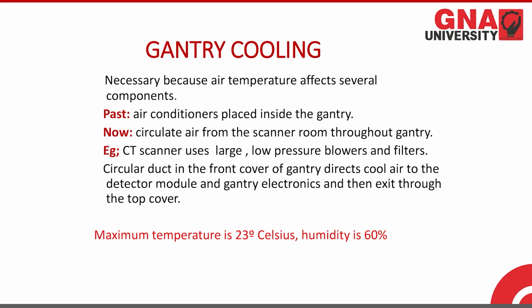For example, a CT scanner uses large low pressure blowers and filters that circulate air in through the front cover of the gantry, directly cool the detector module and the gantry electronics, then exit through the top cover. So remember, the maximum temperature of the gantry should be 23 degrees Celsius and the humidity level should be at 60% only.